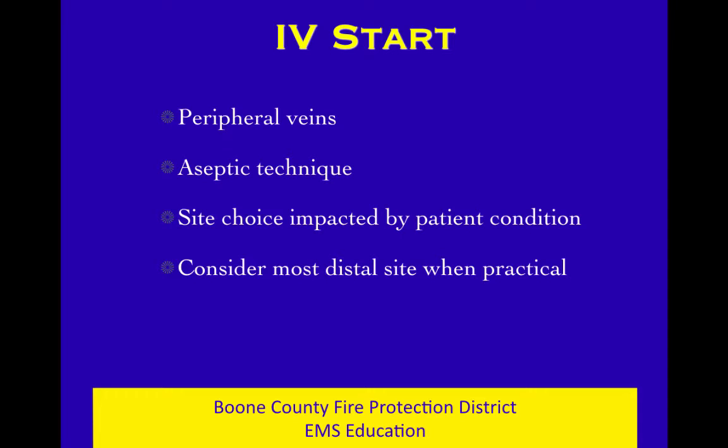We have a checklist that you need to learn. You need to learn the checklist in order and do it the same way every time. The idea is that you're using very little brain to worry about the steps, so you're able to think about other things, and this becomes almost completely a motor skill. So we need to get the steps down. We'll practice them over and over until we get them down.